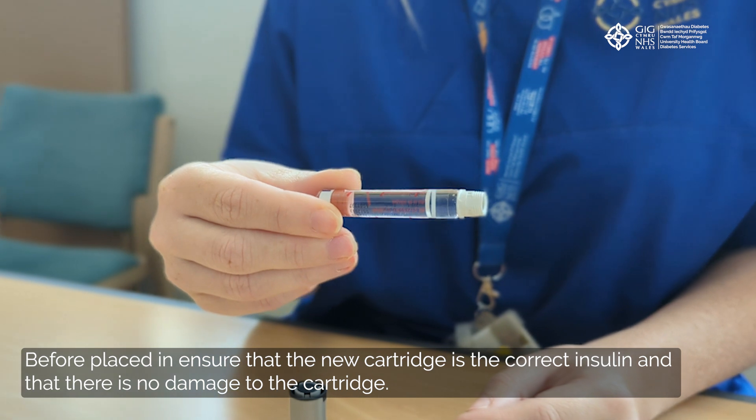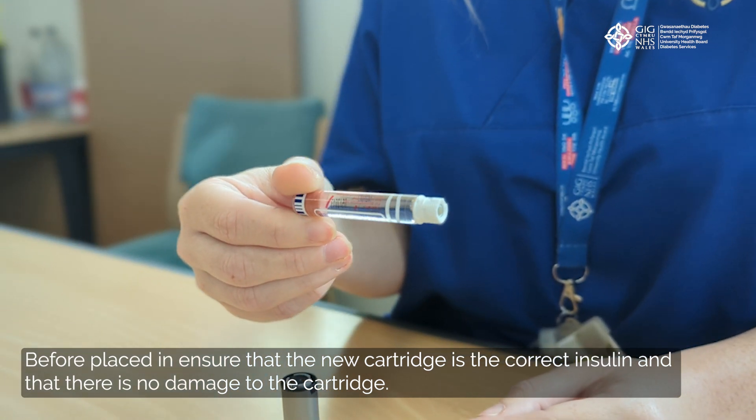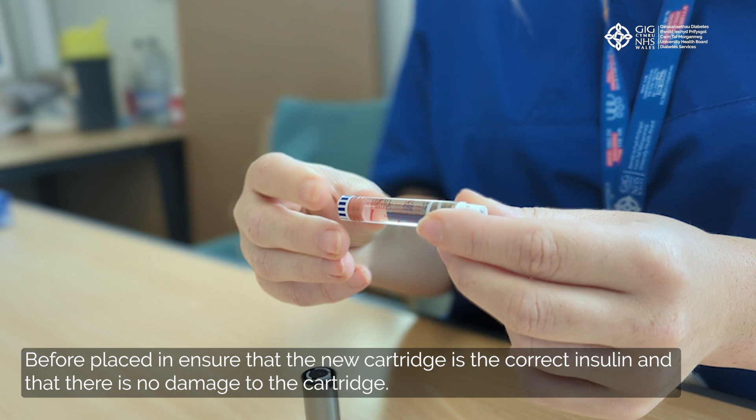Before placing in, ensure that the new cartridge is the correct insulin and that there is no damage to the cartridge.